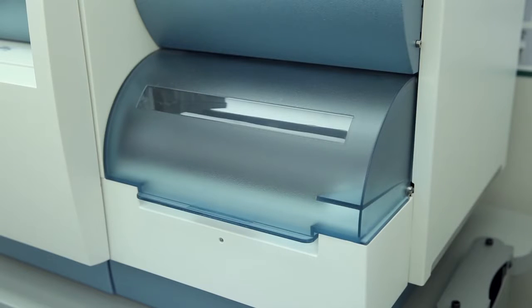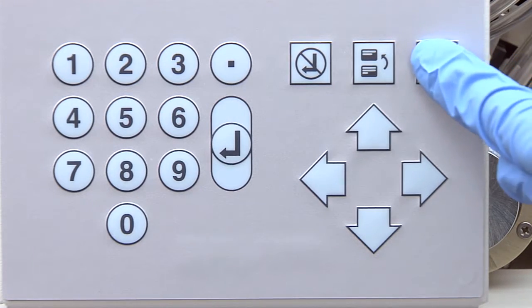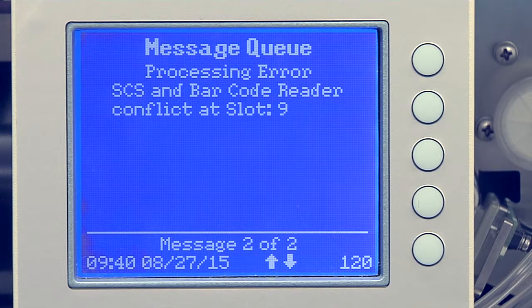If the information does not agree, the cassette is moved back to the Load Unload station and an alarm sounds. Press the Help button on the Vitek2 instrument user interface to acknowledge and read the instrument messages. Note the slot or slots where information is inconsistent with that on the Button Memory module.